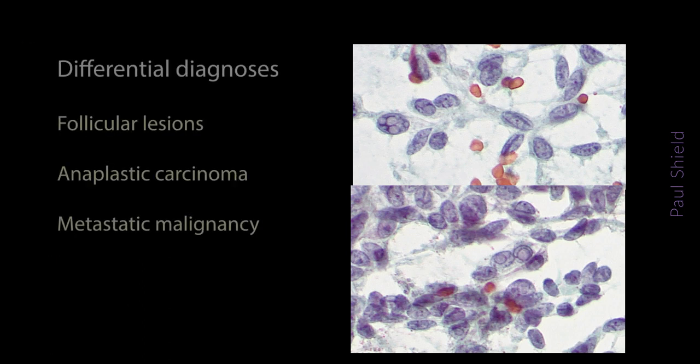Differential diagnoses for this are pretty wide, but certainly include a metastasis, like maybe even a melanoma, or other neuroendocrine tumour, maybe a carcinoid. Features that have been described with medullary carcinoma that we didn't really see include amyloid, maybe sometimes a more dispersed population, and certainly sometimes a more plasmacytoid cell configuration, but this is really highly variable.